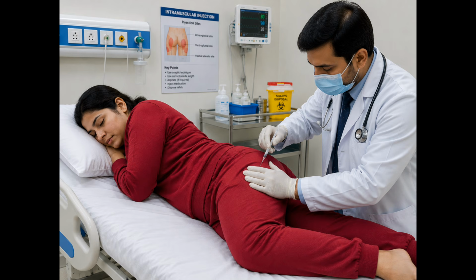Good communication is an essential nursing skill. Before beginning the procedure, the nurse introduces themselves, explains why the medication is needed, describes what the patient may experience, and answers any questions. Clear communication helps reduce anxiety, builds trust, and encourages patient cooperation throughout the procedure. Respect for privacy and dignity should always be maintained. The patient is positioned comfortably according to the selected injection site.